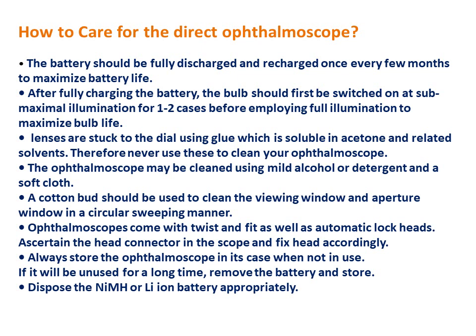Ophthalmoscopes come with twist and fit as well as automatic lock heads. Ascertain the head connector in the scope and fix the head accordingly. Sometimes if you are not very good at fixing this particular head, the equipment may get spoiled and it may have to be repaired. Always store the ophthalmoscope in its case when it is not in use, otherwise it will accumulate dust and it will be useless.